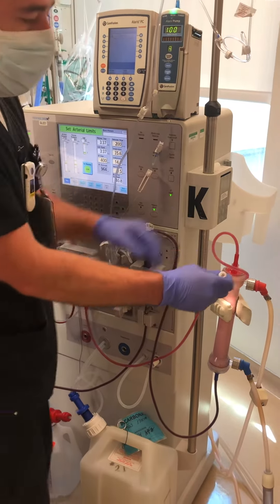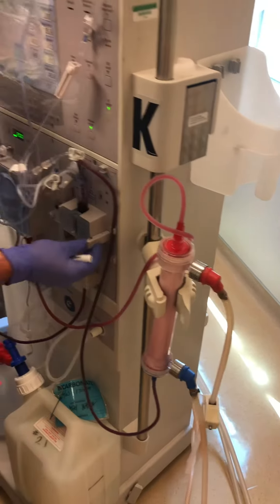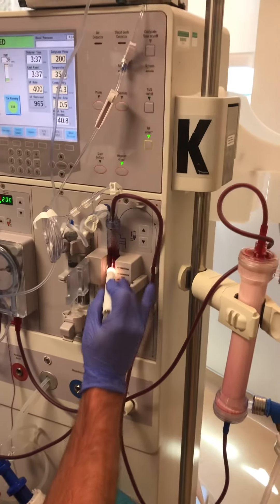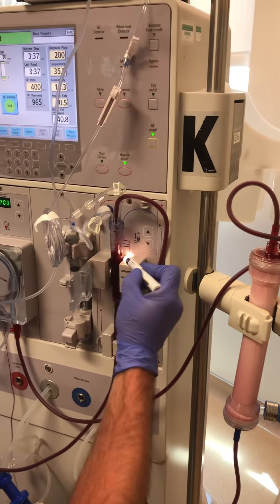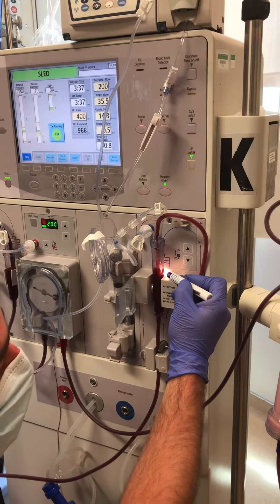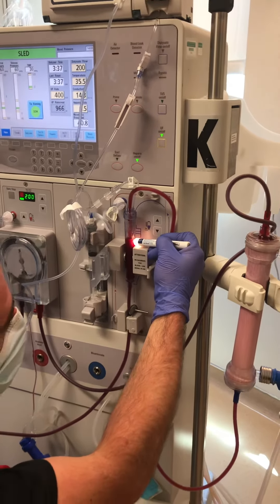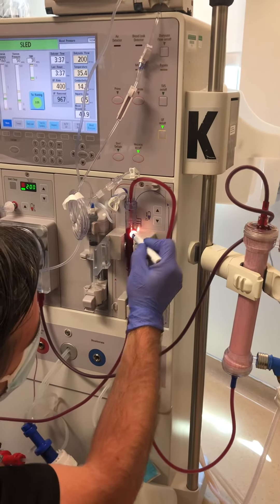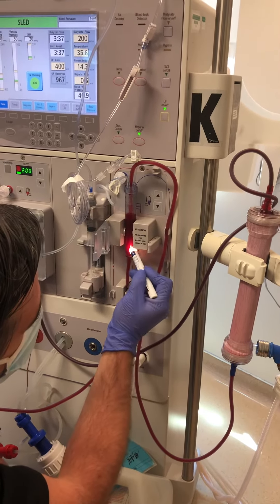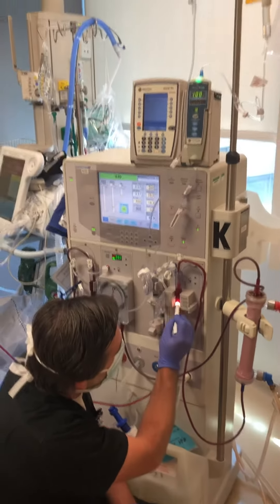At this point I'll check the top of the filter media. Looks okay. And then wait for the saline to make it to the venous chamber, which takes a little while. It never gets quite as clear as the arterial chamber. Looks pretty clear.